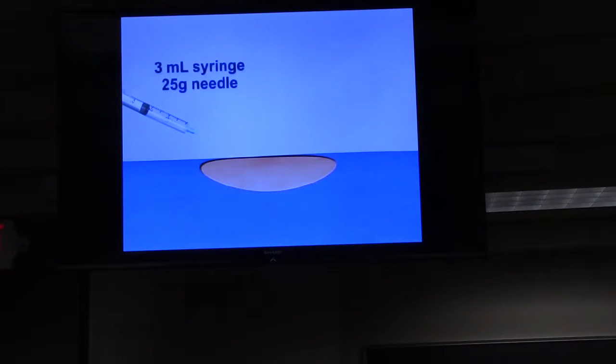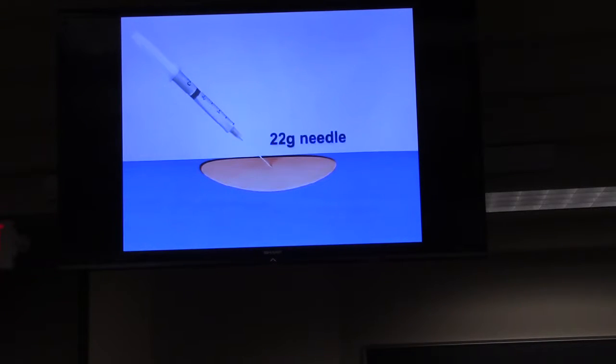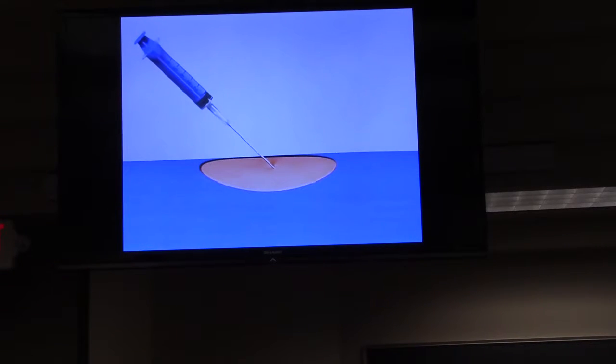Use the 3 milliliter syringe and the 25 gauge 1-inch needle to place a wheel of anesthetic in the skin. Switch to the 22 gauge 1 1/2 inch needle to place anesthetic into the deeper tissues. Next, attach a 5 milliliter syringe to the 18 gauge 2 1/2 inch introducer needle and advance toward the vessel. Pull back on the plunger as you proceed. Blood will fill the syringe when the vessel is entered.